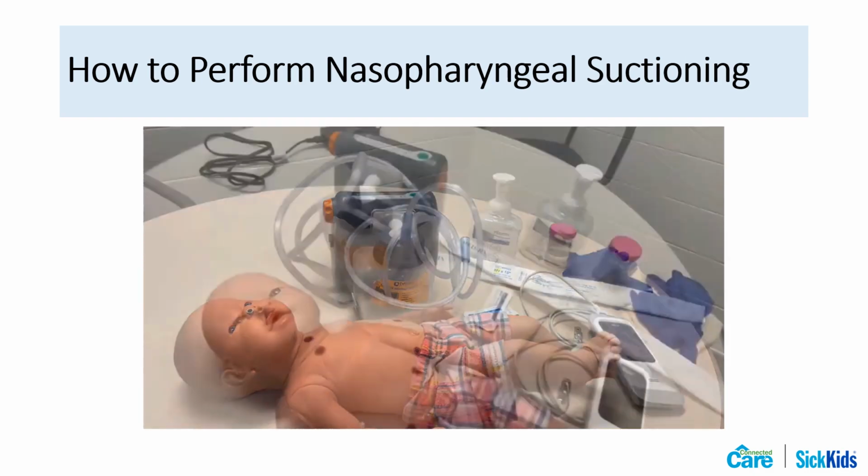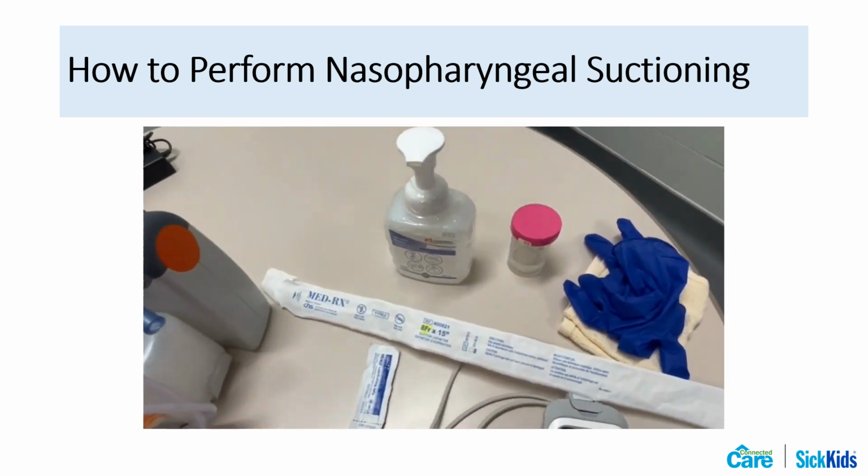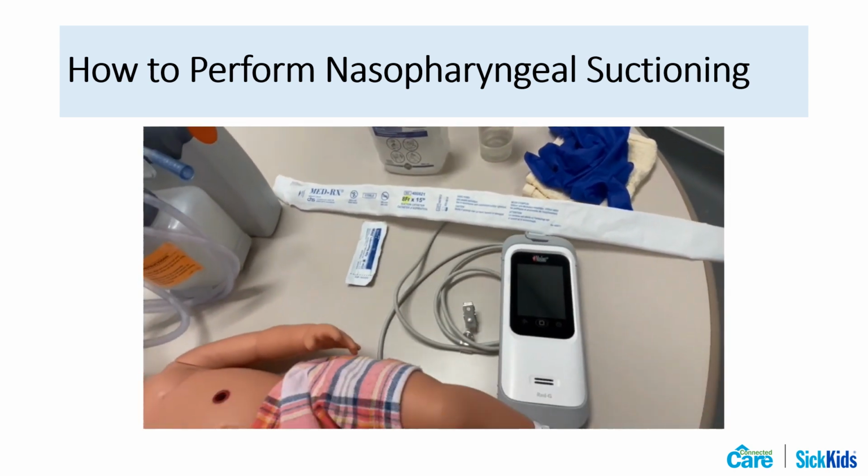This video will demonstrate nasopharyngeal suctioning. Gather your equipment and supplies and have them nearby.